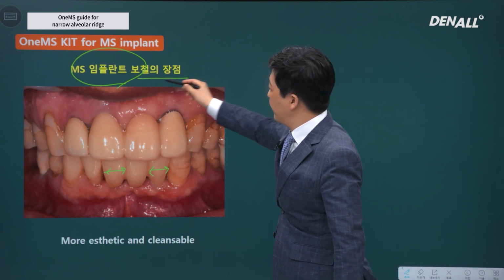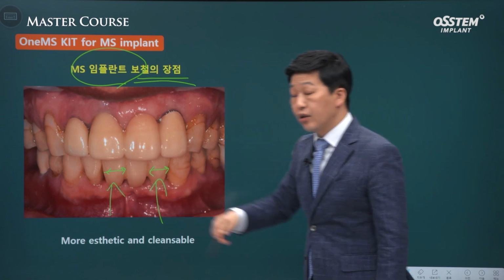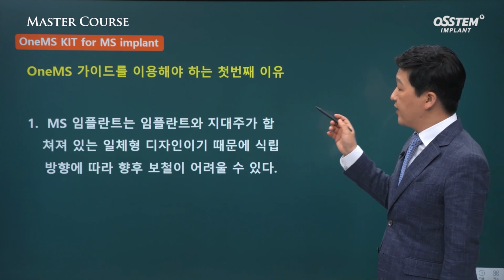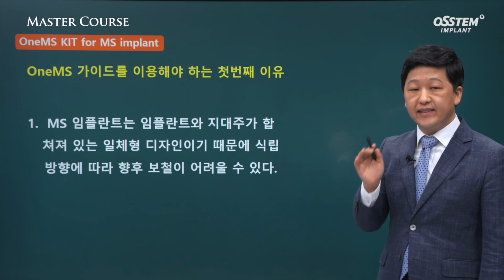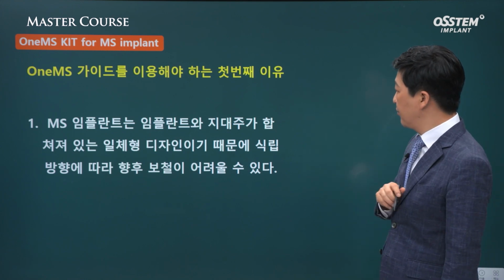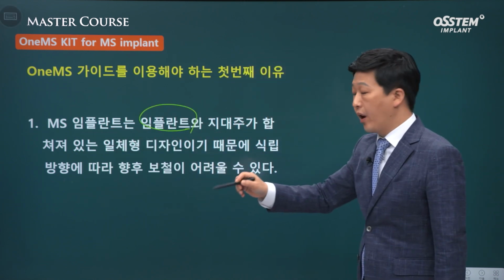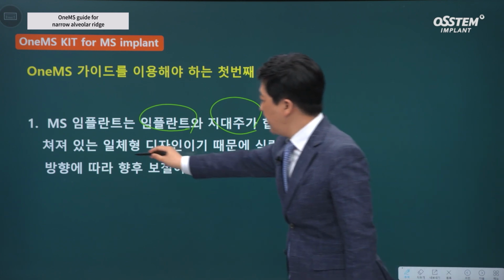One body implant. I recommend using this one body MS implant in lower anterior area. In order to place MS implant, there are a couple of reasons why you need to use a OneMS guide. MS implant is a one-piece design where implant and abutment are combined.